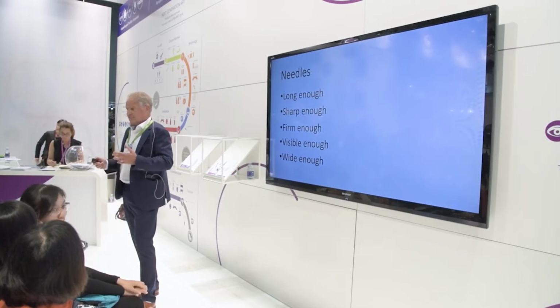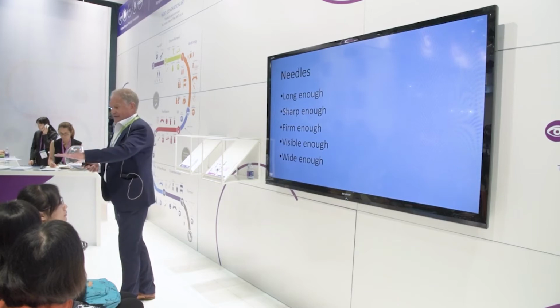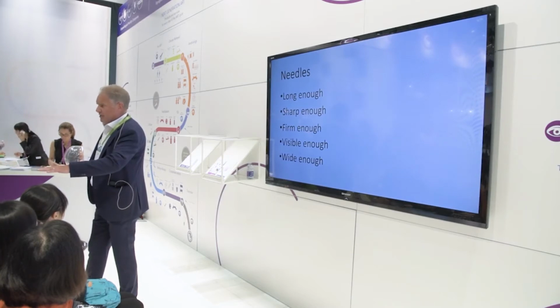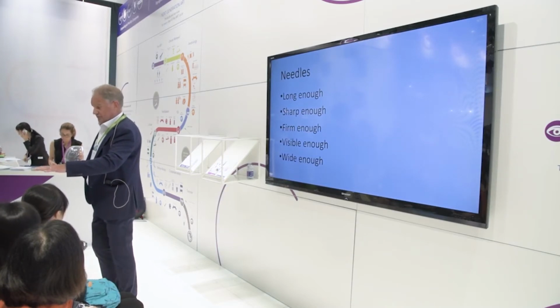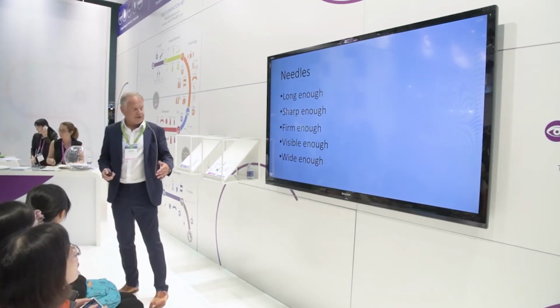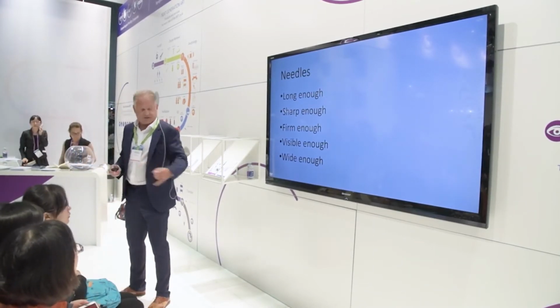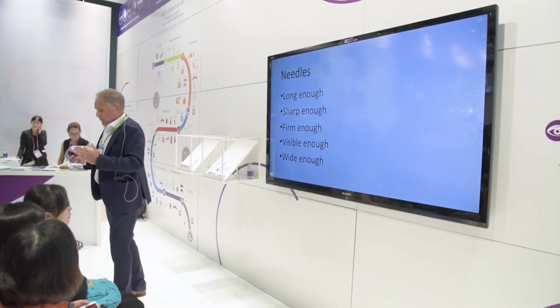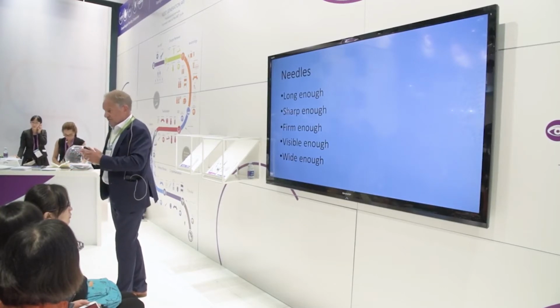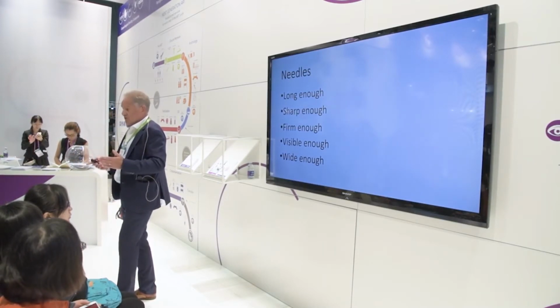It was described to me by anaesthetists that if you take a big slug of Pethidine and then you put your hand on a hot stove, you'll say, well, I know my hand's burning and I know it hurts really, really a lot, but who gives a fig anyway? So a lot of patients didn't have the benefit of the modern anaesthetic agents. So what I wanted to do was to create a needle that was narrow enough to be as painless as possible, but had an internal diameter that was as wide as possible.